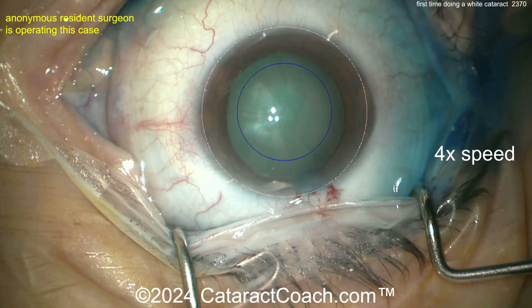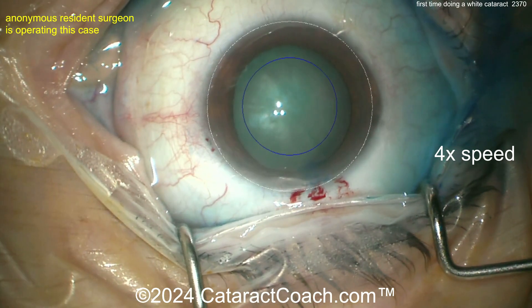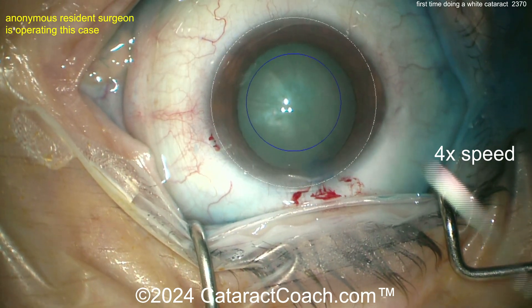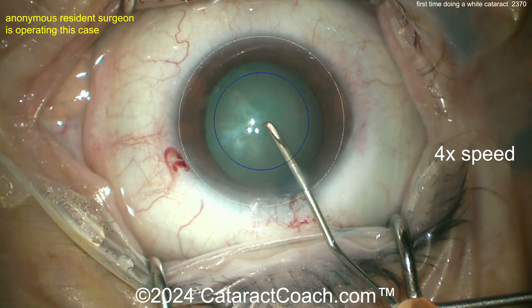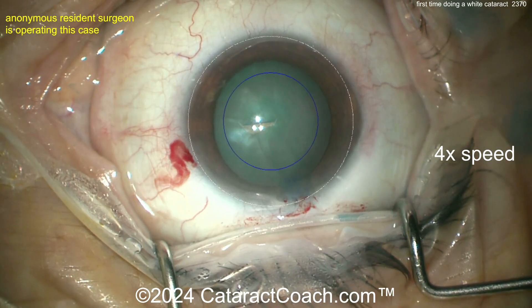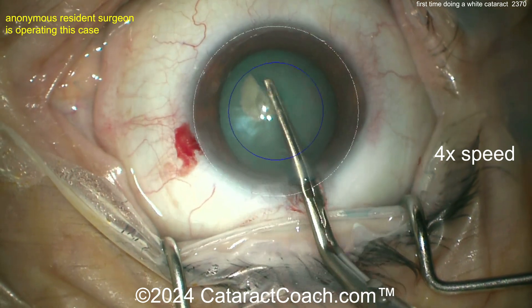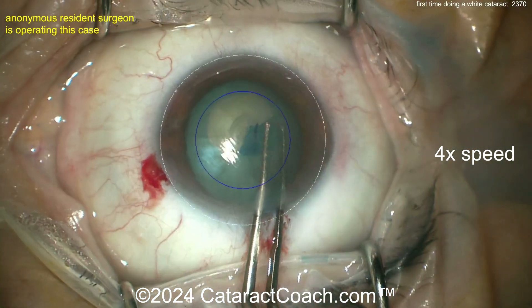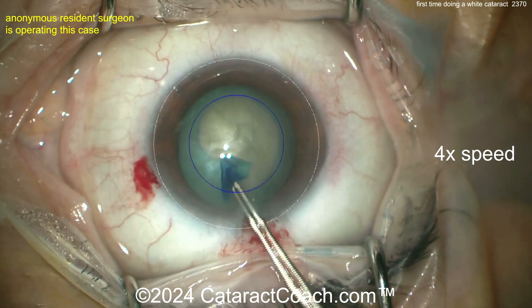Viscoelastic going inside the eye — that looks great. Now, are you going to do a regular rhexis or a needle decompression? One thing I would have done is fill the eye with BSS before the viscoelastic, then touch the anterior lens capsule to see how pressurized the capsule bag is. Luckily it's not too pressurized, so this is a white cataract but it's not intumescent or fluid-filled — very little liquefied lens cortex. As the rhexis is being done tracing that outline, there's no release of lens milk, confirming this was not an intumescent white cataract.